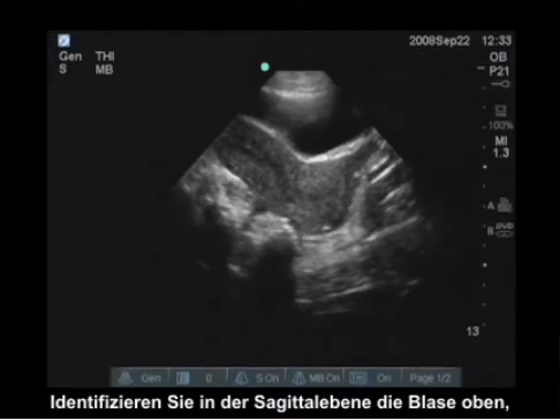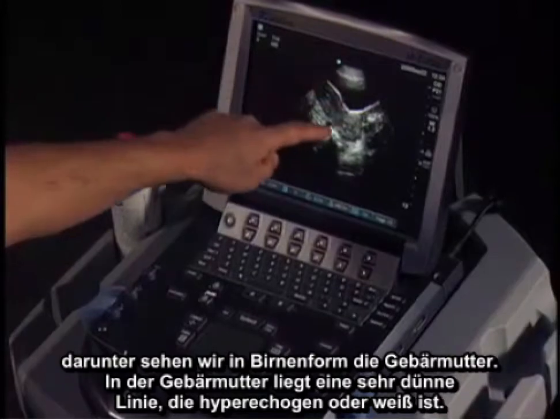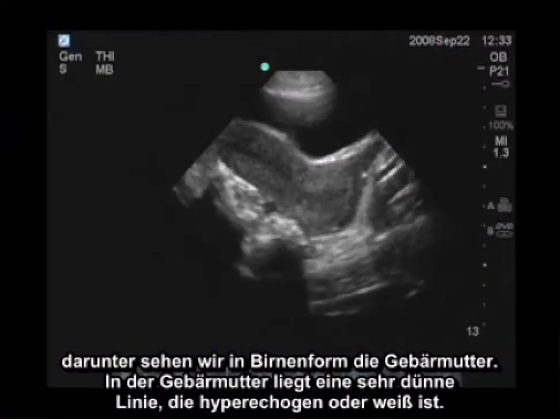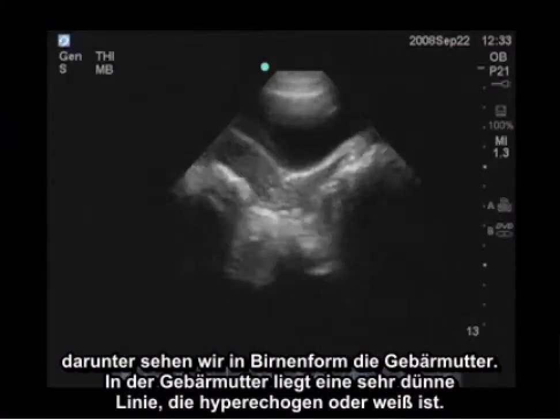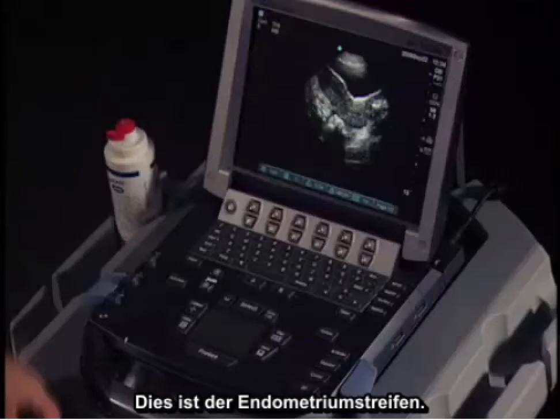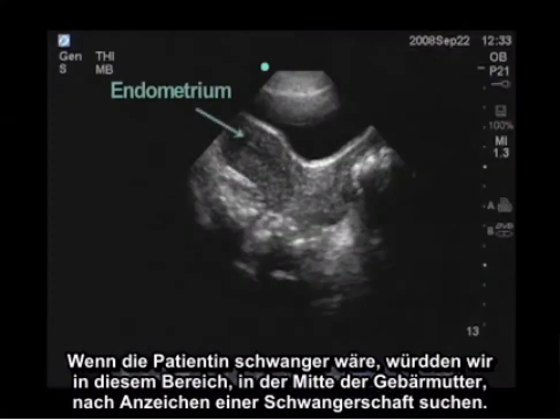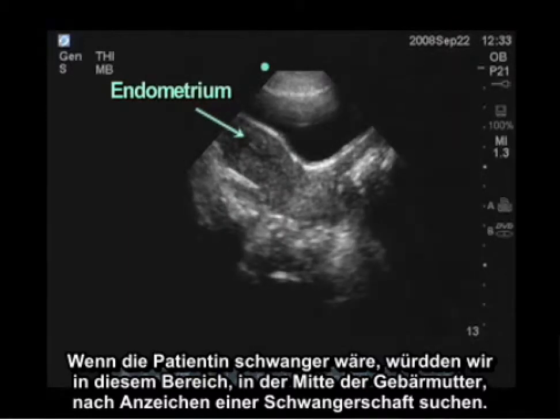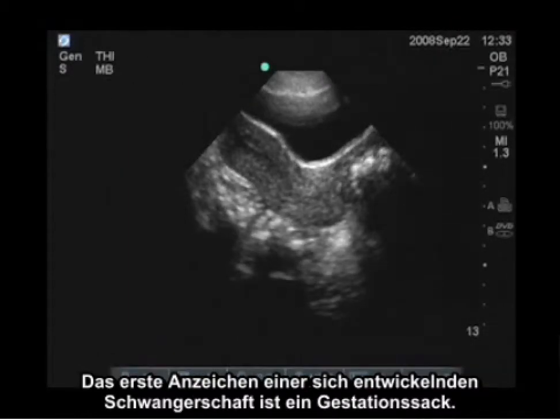When scanning in the sagittal plane, you identify the bladder at the top. Below that, we see the pear-shaped uterus, and within the uterus we see a very thin line which is hyperechoic, or white. This is the endometrial stripe. If the patient was pregnant, we would be looking for signs of pregnancy within this area, within the mid-uterus.